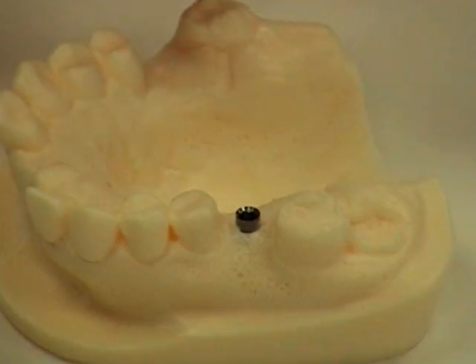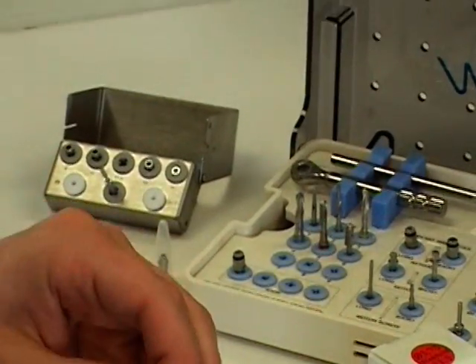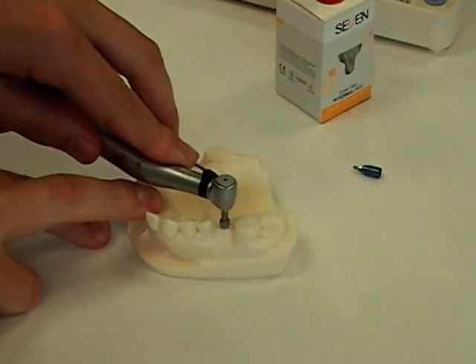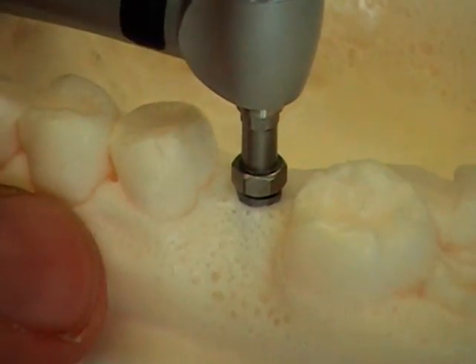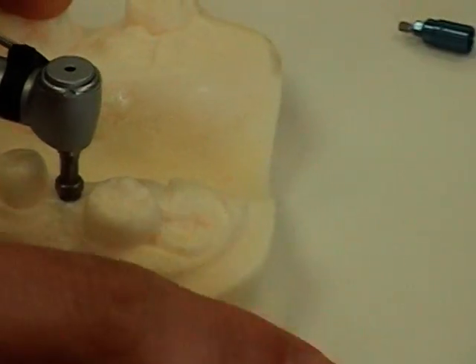We'll connect that to our handpiece, insert it in, and begin tightening. You'll see that as before, we've set the torque rating of the motor so that when it reaches the specific torque, it will not continue to tighten any further. Remove the tool and the implant is inserted.